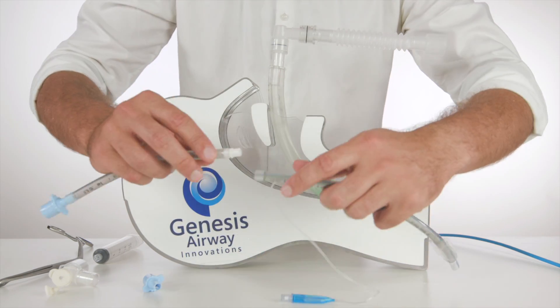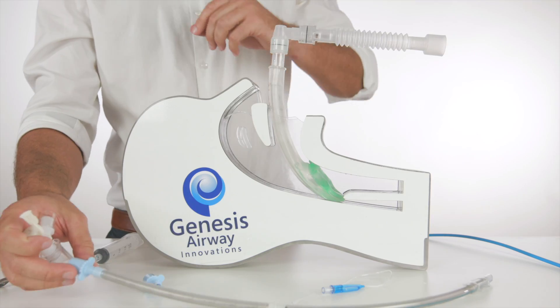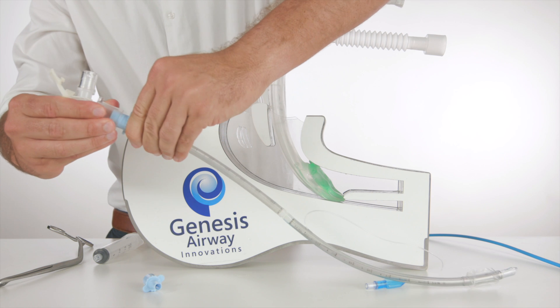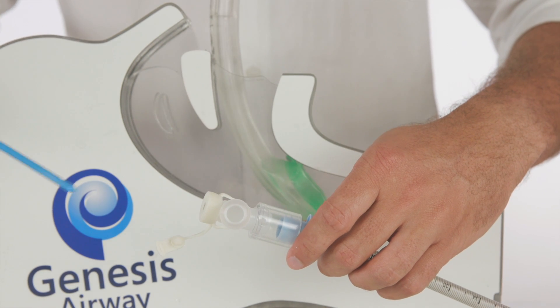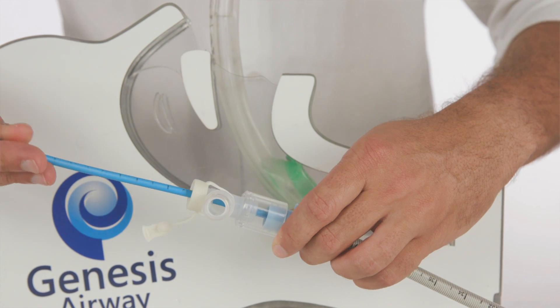To begin, we connect the endotracheal tube to the reinforced tubing extension. We then attach a self-sealing connector with a sidearm, and ideally we would then advance a fibre optic bronchoscope through the tubing. However, in this video we will demonstrate using a bougie.